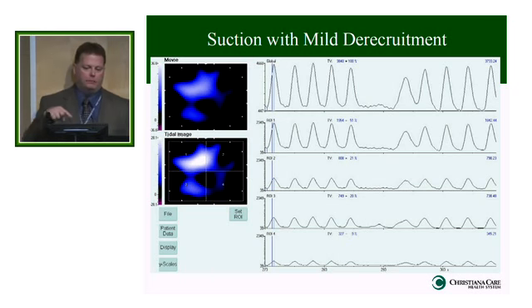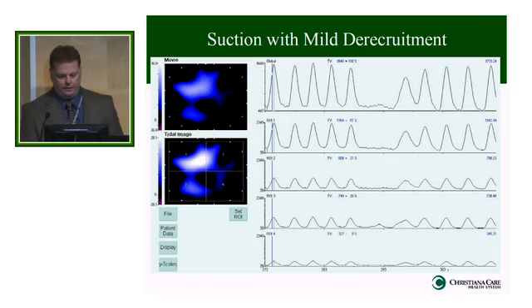And this is just another one to show you the imaging. We happen to have a CAT scan the same day of the imaging of this. If you see this here, we've got consolidation here. We've got a little ventilation here, and then this lung looks like it's ventilating. And in reality, we have that ventilation here and some up in the upper quadrant, but definitely no ventilation on EIT down where all this is happening. So again, using that imaging live right at bedside, just a chest belt on the patient, to be able to monitor whether they were de-recruited or not.